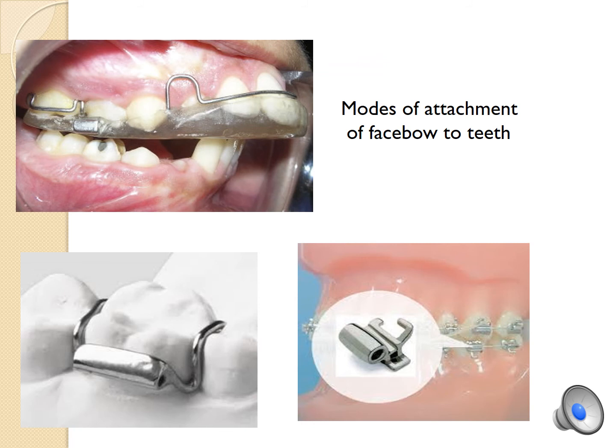This is the intraoral view of the face bow that connects to the teeth. So what happens is that intraorally there is an appliance that has components which connect the face bow to the appliance. You can see in the bottom picture something that looks like Adams clasps, and at the bridge there is something connected, which we call a tubing.